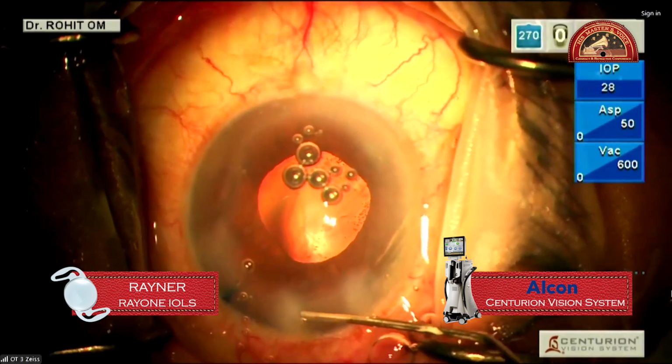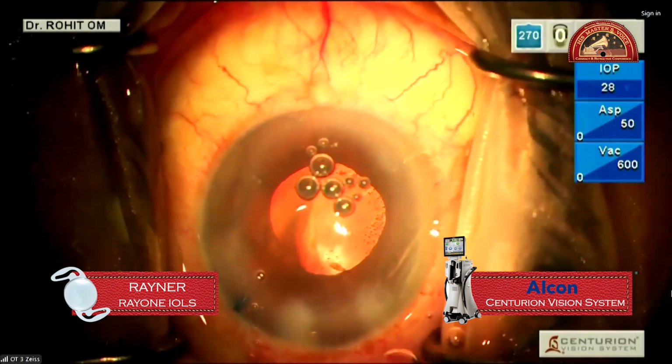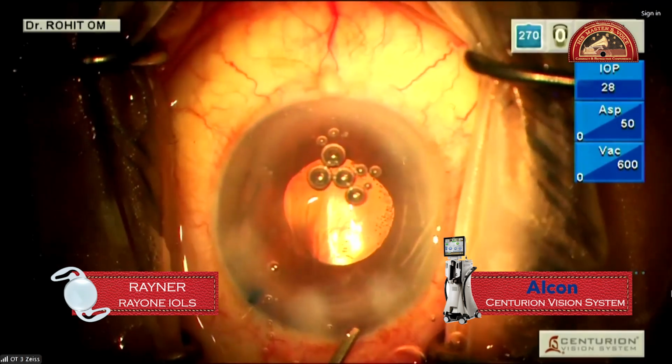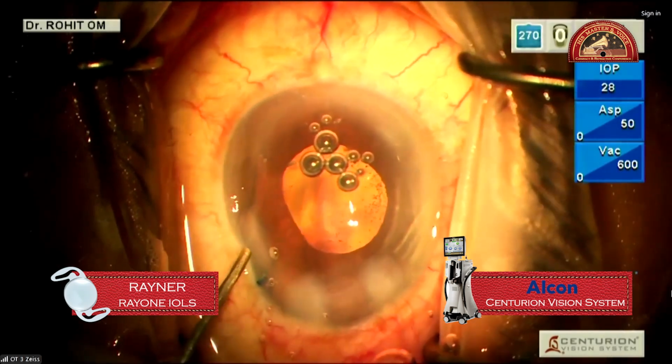You have to take time for the incision to seal, because the sclera is elastic and thin in these patients. You have to be clear that it is definitely sealed before you move on. You should not rush at this point of time.